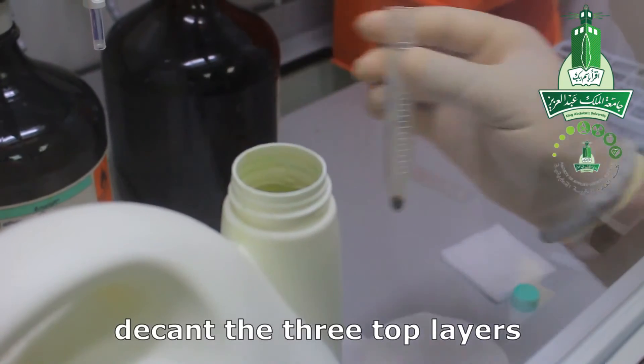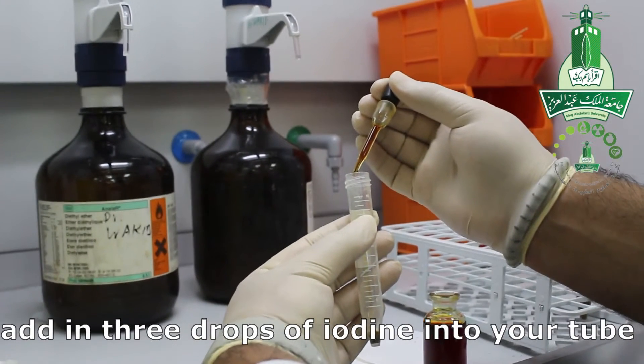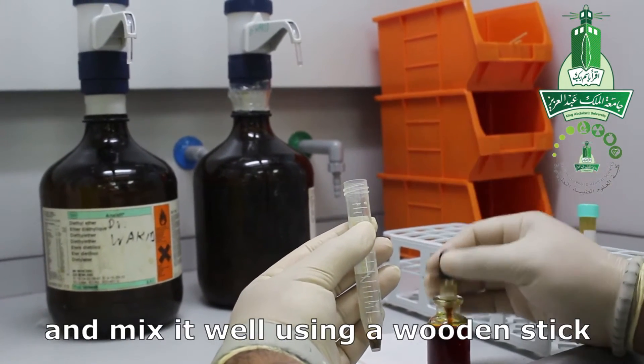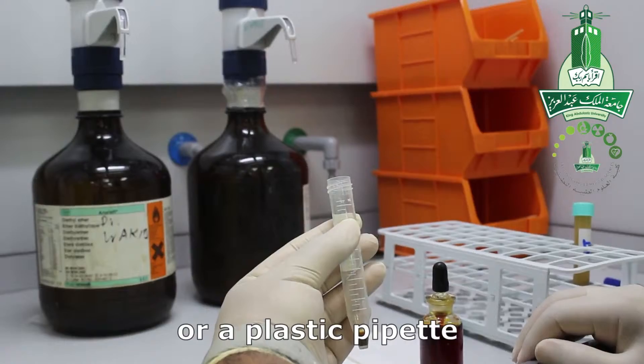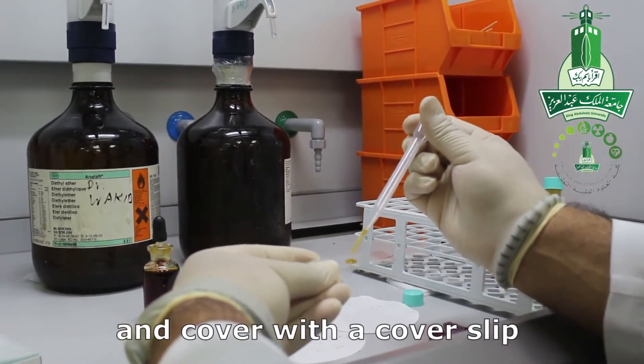Then decant the three top layers and add three drops of iodine into your tube. Mix it well using a wooden stick or plastic pipette. Take two drops onto a slide and cover it with a coverslip.